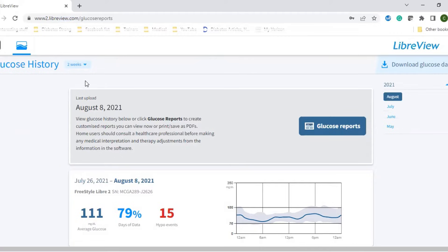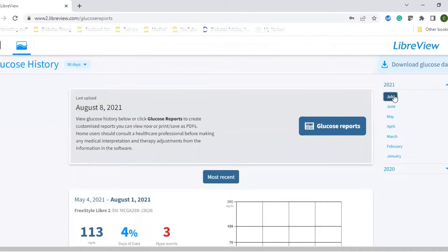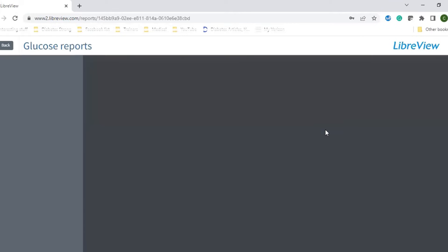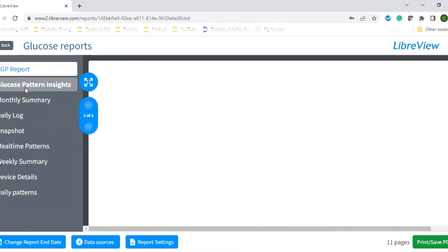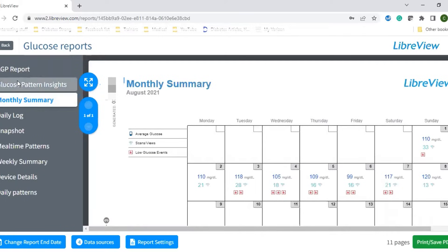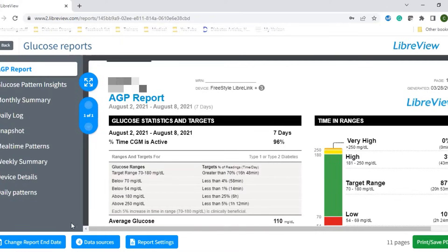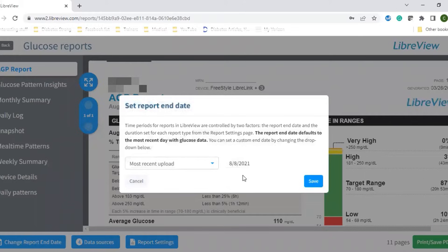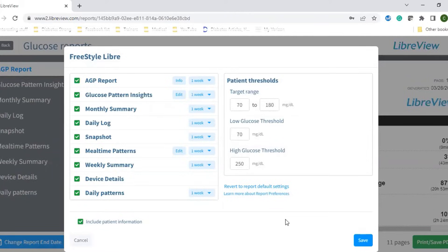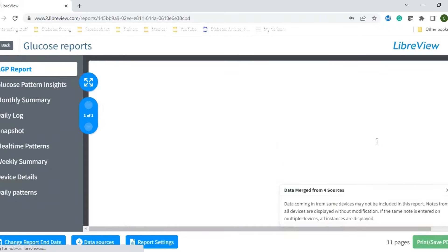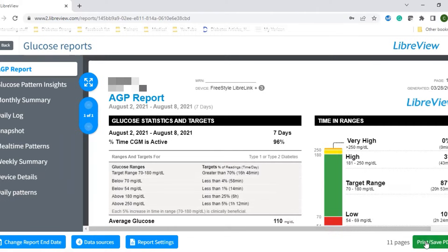All your glucose history will then be shown. You can choose how much time you want to see — you can go all the way up to 90 days. You can also choose different months. I don't have a lot of data in here because I don't use the Libre regularly, but you can choose whatever month you want. Then click Glucose Reports and it starts to load. This is the AGP report. You can click on whatever report you want to see: patterns, monthly summary, daily logs, etc. You can also change the dates and settings.